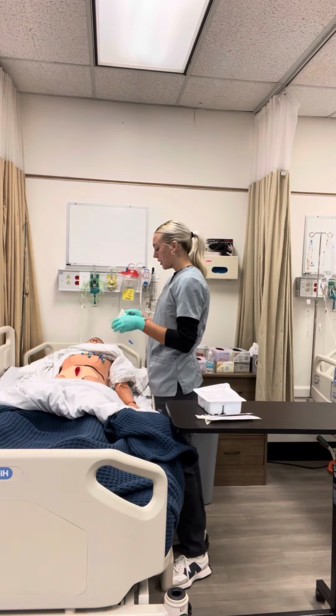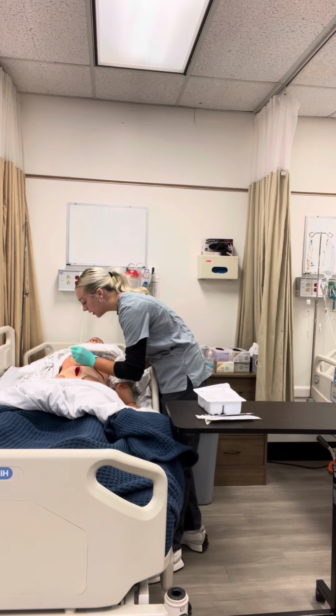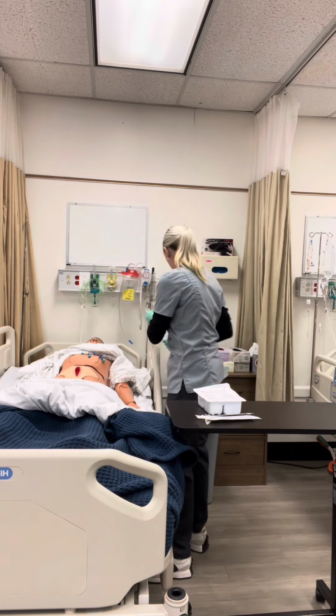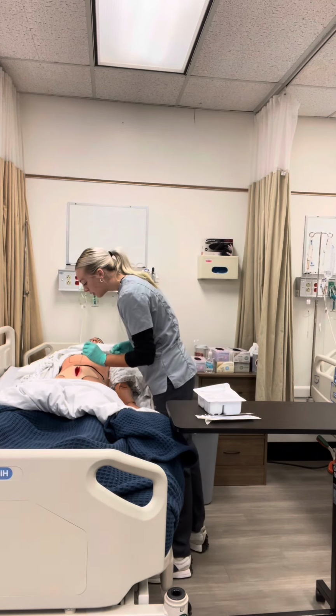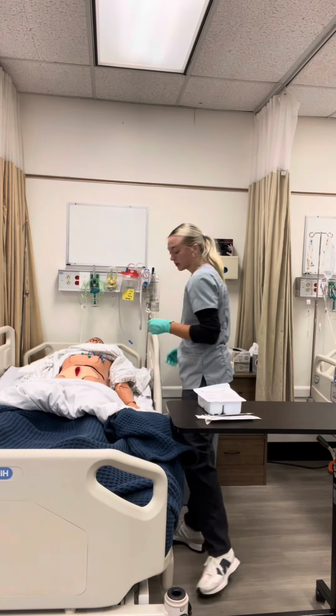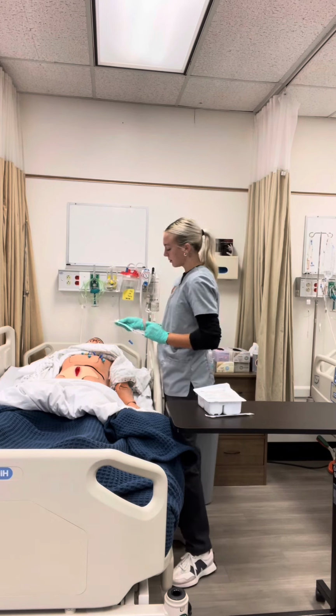So I'm going to take my cotton swabs. I'm going to check each side for tunneling. I'm just going to lightly run my swab around the edges. Okay, no tunneling is present. That's great. Now I'm going to measure my patient's wound.